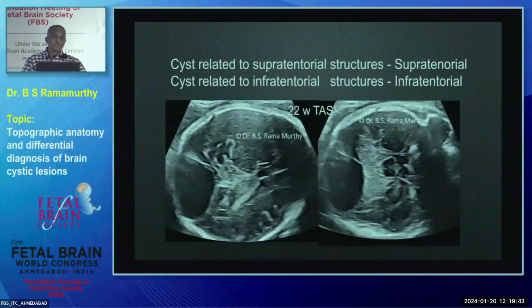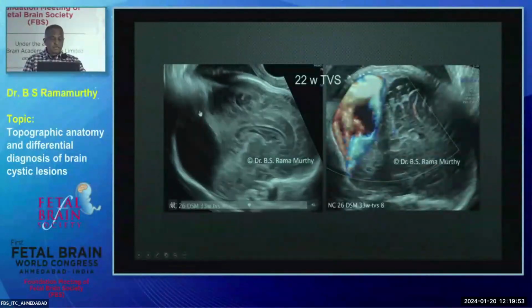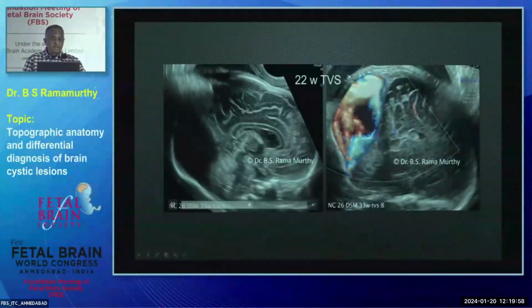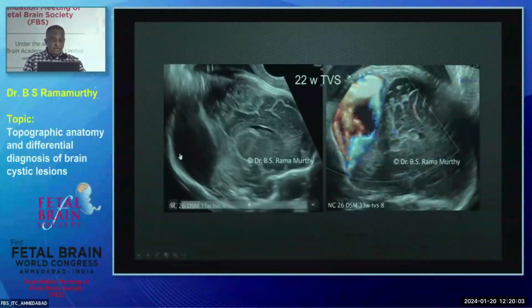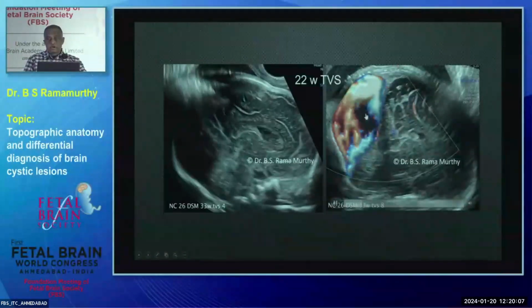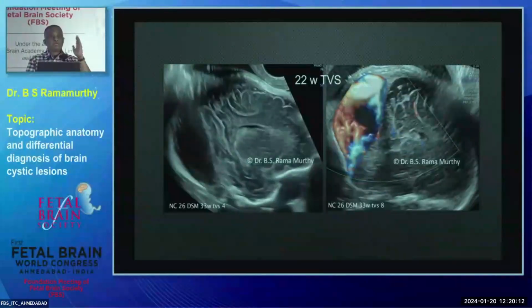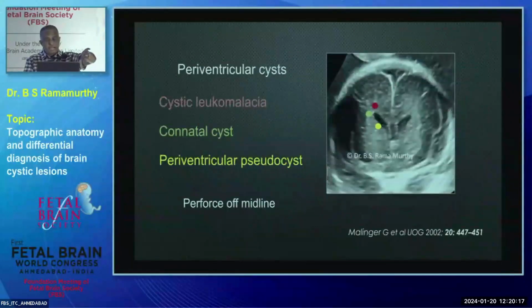Subdural. Subdural. It took me some time to sort it out years and years ago, but after that, the subsequent diagnoses were also easy. So you go mid-sagittal, and you know that the cyst is extra or subdural, pushing the supratentorium anteriorly, pushing the infratentorium also anteriorly. You turn the color Doppler on, and that's a huge dural sinus malformation, and you know that you've hit your diagnosis straight. And supratentorial parenchymal, and this is Dr.